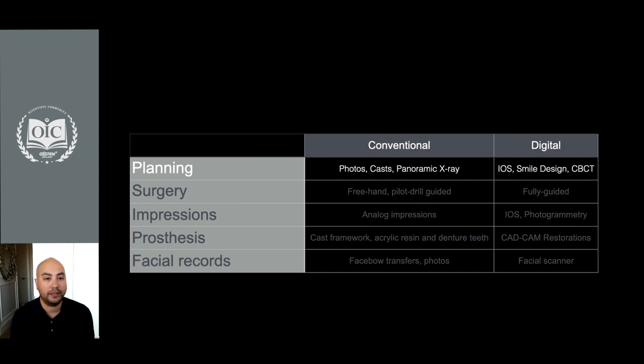Conventionally, we take pictures, we plan on a cast and then on an OPG, whereas digitally we now utilize intraoral scanning, smile design, and cone beam.